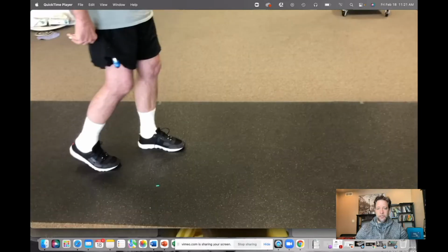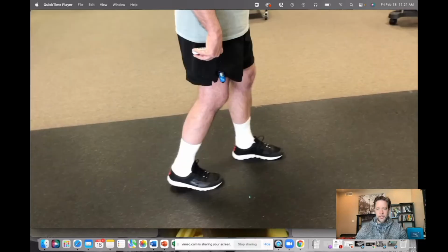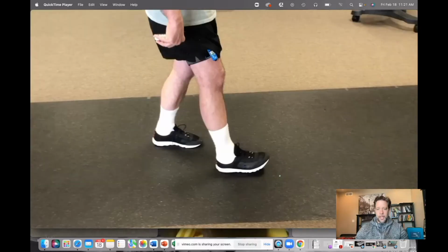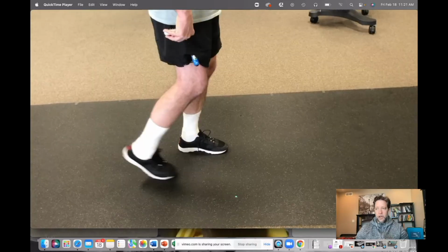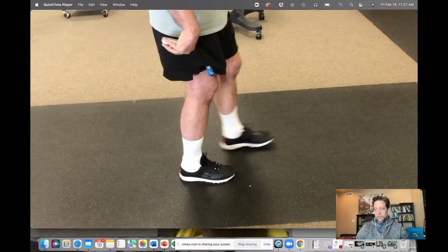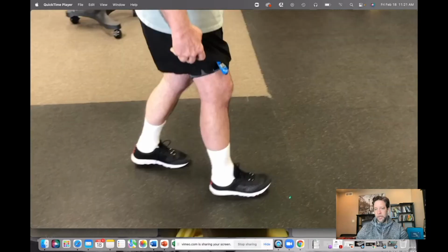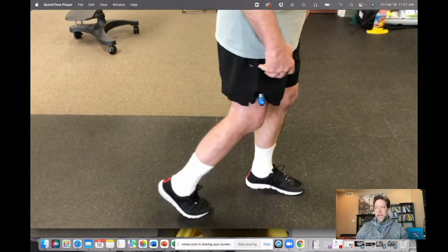He still has a heel strike coming through during swing phase and initial contact. And now he starts to get it. He also got a patient pack for home because he was fear avoidant of falling, okay, liked to stay in his walker around the house. This is several months later, but he was complicated. I needed him to get daily feedback on getting that knee to flex during the gait cycle. So keeping the toe on the ground longer and then hitting the heel for initial contact as he went through.